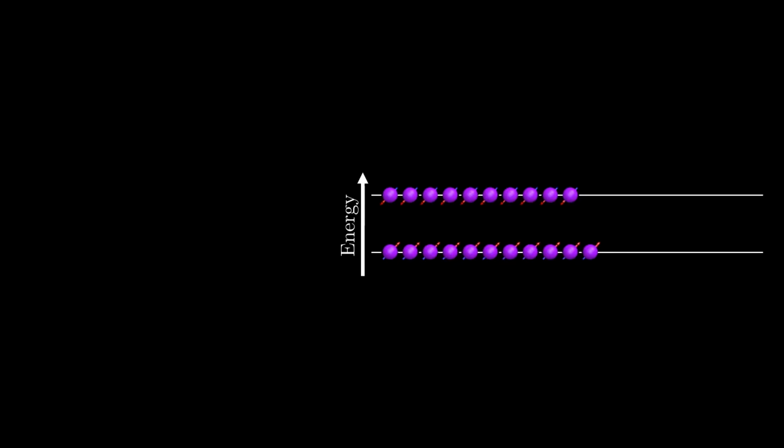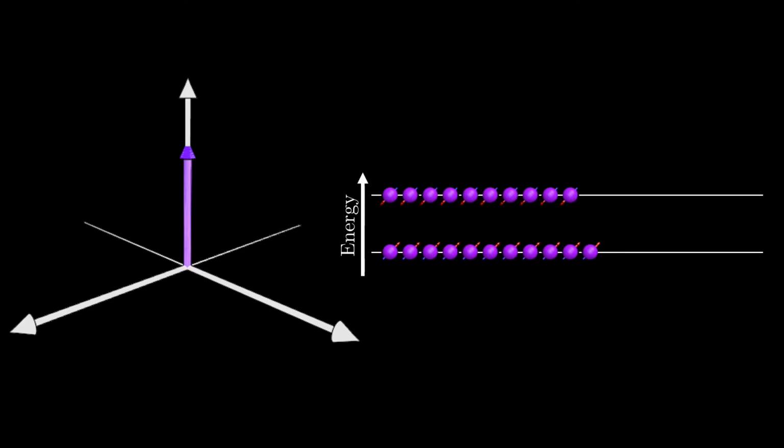The dynamics we're examining pertain to ensembles of many protons. For example, the longitudinal magnetization in our sample, i.e. the magnetization pointing in the direction of our field, is actually representative of the number of protons in each state. Higher if more spins are in the spin up state, negative if more spins are in the spin down state, and 0 if there's equal numbers of spins in each state.